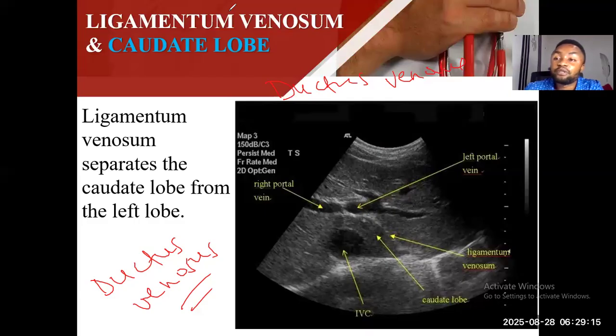If you are doing obstetric Doppler, then you can detect all these because it contains oxygenated blood. It shunts oxygenated blood to the inferior vena cava in embryology, please. Because vein does not contain oxygenated blood, but in fetal development, veins rather contain the oxygen. You understand? So if you use Doppler, as Isa is saying, yes, you can pick it up. You understand? That is in embryology.